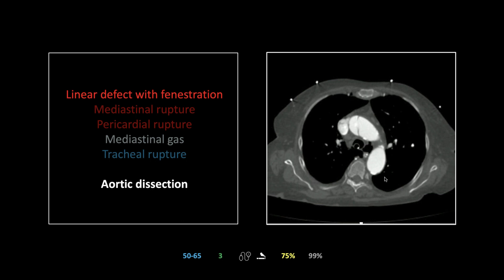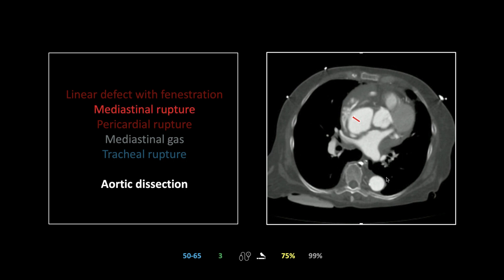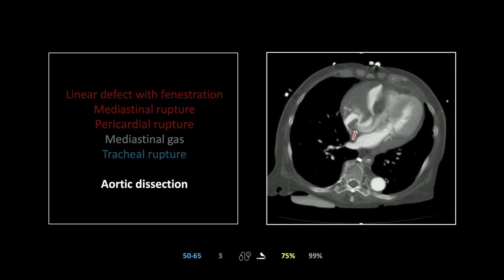There is a linear filling defect with a small fenestration — contrast on both sides in the false and true lumens — and the lower portion of the flap again with a fenestration, starting right above the aortic valve. There is rupture into the mediastinum at the base, probably from the false lumen, with blood tracking extravascularly down into the pericardium. This is a hemopericardium — the pinched appearance is likely due to clot throughout the pericardium. The right side of the heart is practically vanishing from compression.